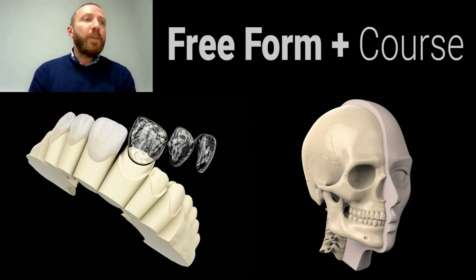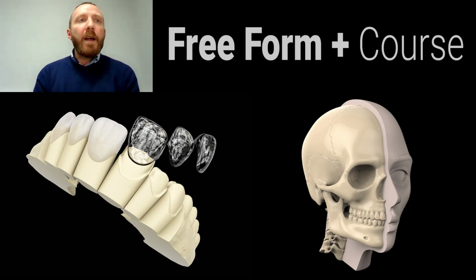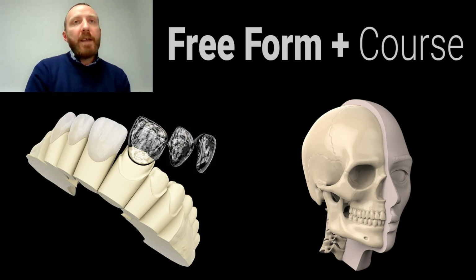Many specialized software for dentistry have limited functionality. They are designed to perform specific tasks. The software is valued for simplicity and speed, but when we have a difficult task, they cannot help us.